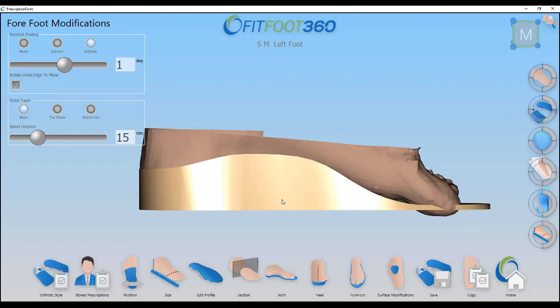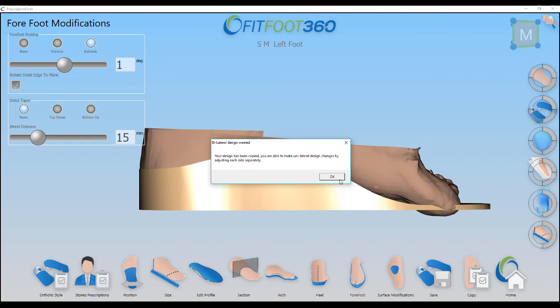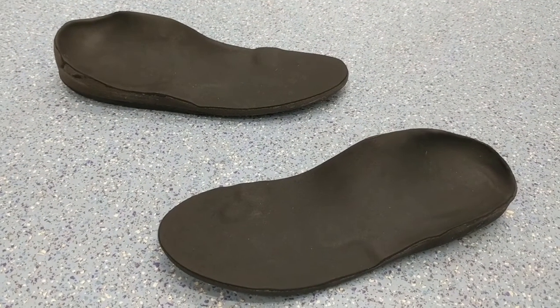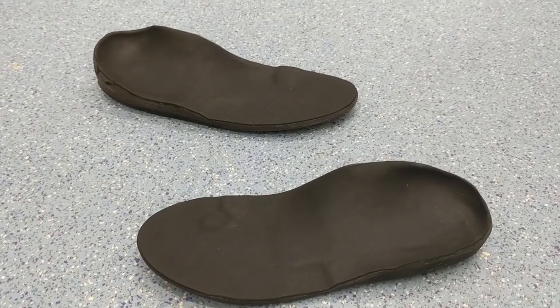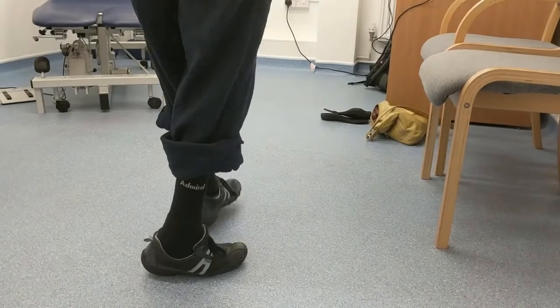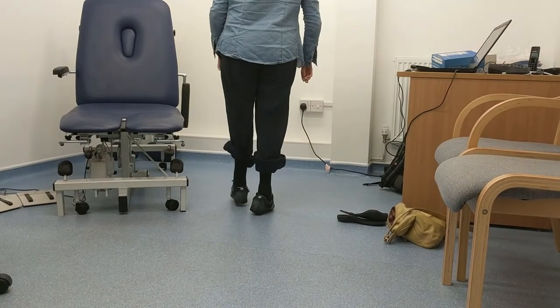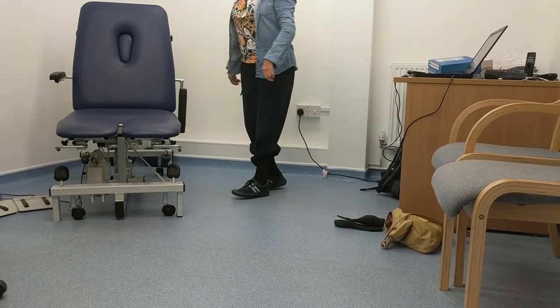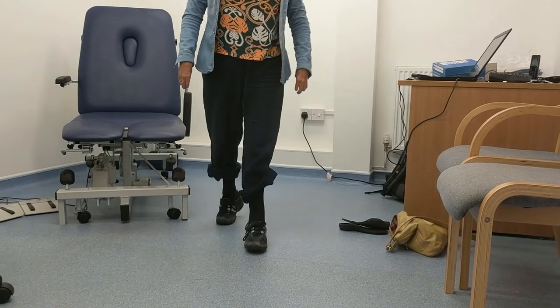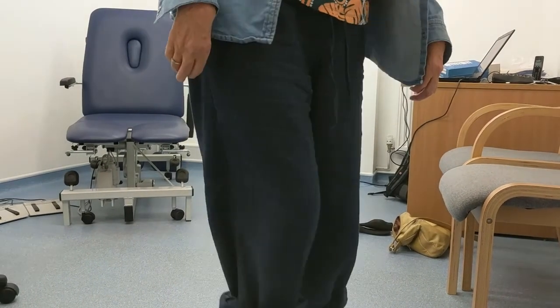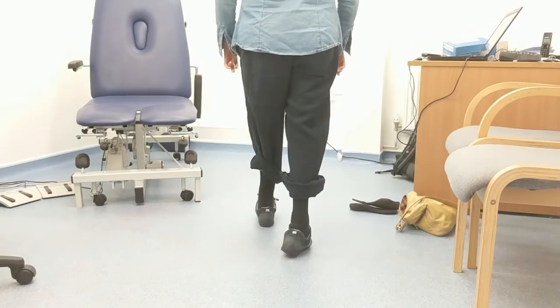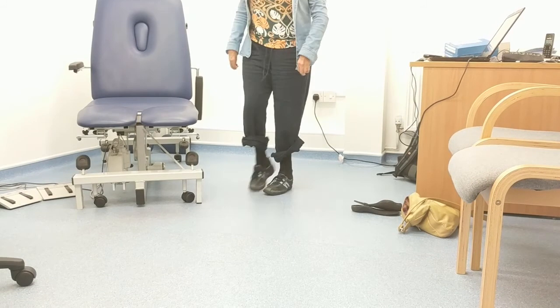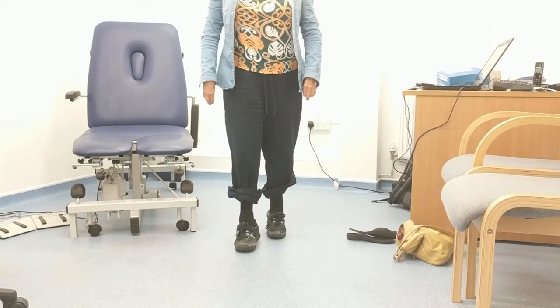We now have our finished orthosis on the left, so we save that. We want something very similar on the right and can copy it straight across. The completed orthoses have been milled out of polyurethane with a one-millimetre EVA cover just to stop the polyurethane from degrading. Putting those into the shoe and looking at walking again, you can see a massive improvement.